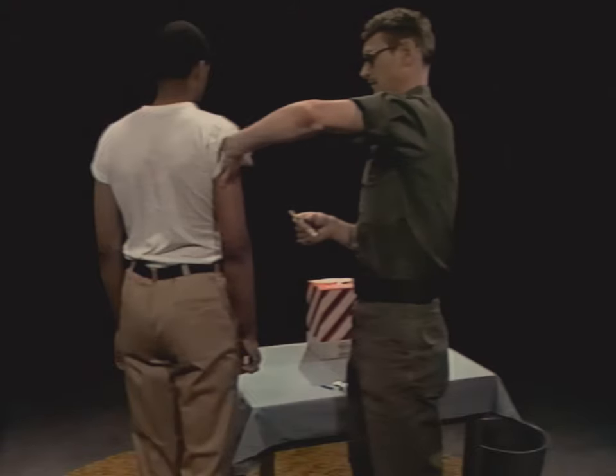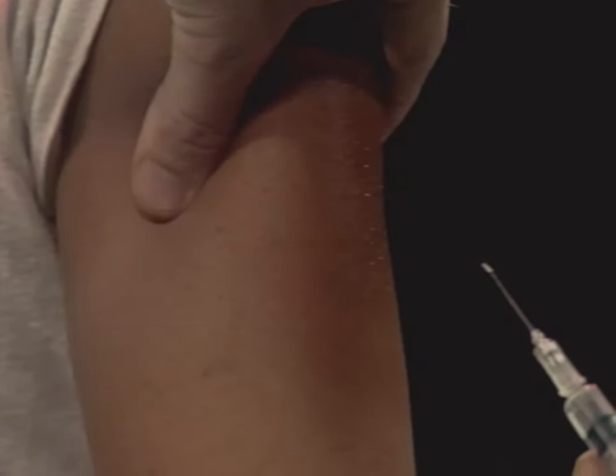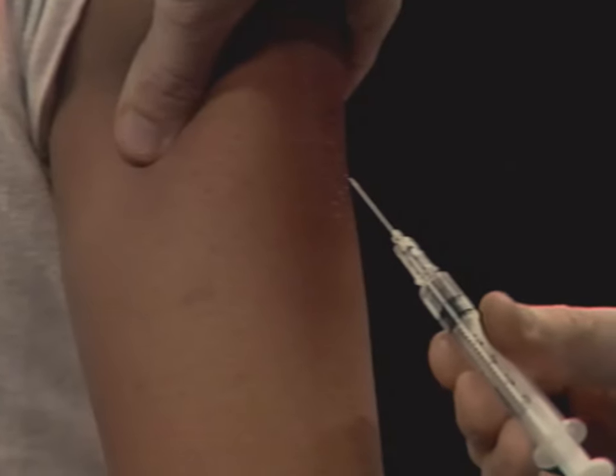With your other hand, pinch the skin of your patient's arm and hold it firm. Hold the barrel of the syringe with your right hand between your thumb and index finger. Check to see that the cutting edge or bevel of the needle is pointing up toward you.